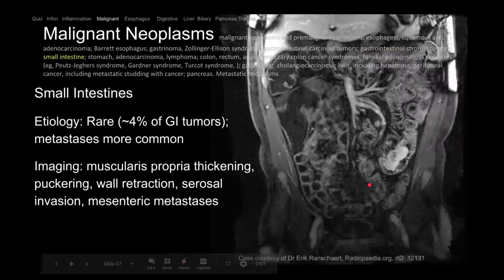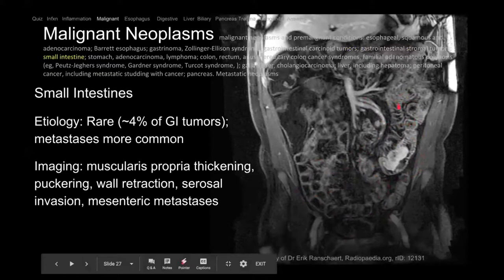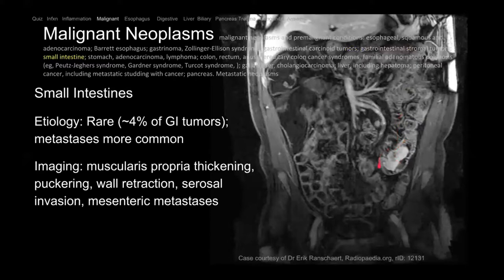In contrast to GIST, here is an MRI enterography. We see the mesenteric vessels — SMA, SMV — are bright. MRI lets us look at the bowel beautifully. This is normal jejunum and normal ileum — the jejunum has more folds than the ileum. The wall looks thin and is not distended, which is normal. But in this segment of the jejunum, there's a bright enhancing structure inside the wall — this is a small bowel tumor. Small bowel tumors can be benign like lipomas or malignant like carcinoid, and metastatic small bowel lesions are actually more common than primary bowel tumors.